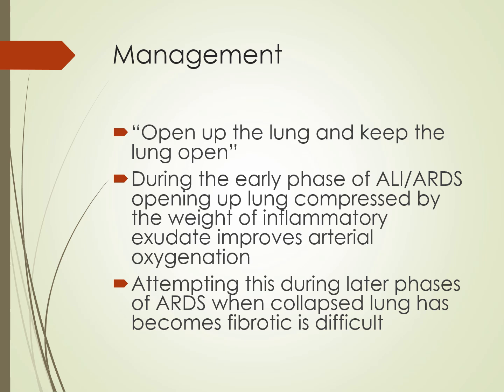The open lung concept was a proposal to use recruitment maneuvers followed by higher PEEP to reduce atelectrauma and shear stress injury. A universally accepted protocol for open lung ventilation does not exist. Everyone has their own ways of doing it. You could use APRV. You could also use a high-frequency oscillator ventilator. You could also use the ARDSNet protocol.